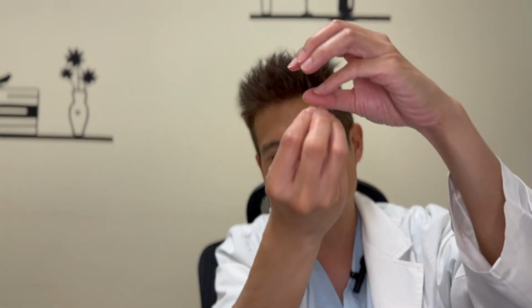He took another injection to check through the guiding, not through the microcatheter. And you can see literally on screen, this little septal hematoma just grew a little bulb at the bottom, and that bulb just went bloop into the pericardium. The patient went into tamponade, and there's CPR, there's pericardiocentesis, and there was a big hoo-ha in the whole audience. Now, I later learned from Dr. Saito, because we're good friends, that the patient had been on long-term steroids, and we put that case down to the fact that her myocardial tissue may be a bit weakened through long-term steroid use.